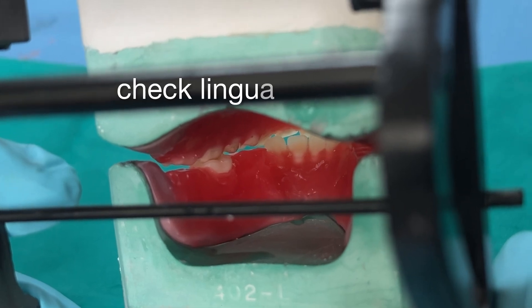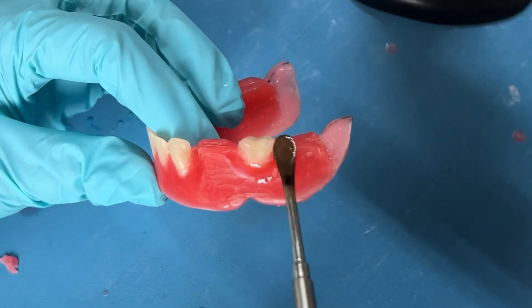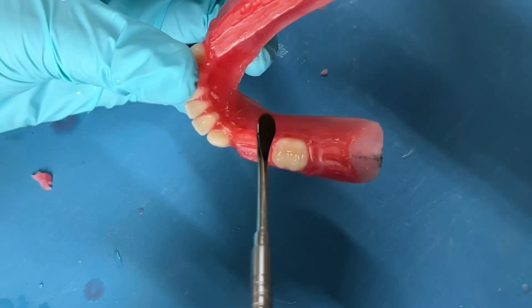Turn the articulator and check the occlusion from behind to see that you have a perfect lingual occlusion too. Once everything is satisfactory, seal the wax all around the tooth to set it firmly.